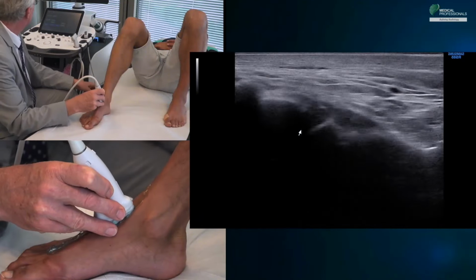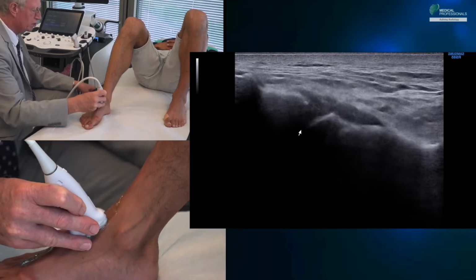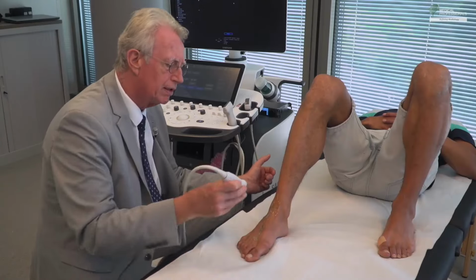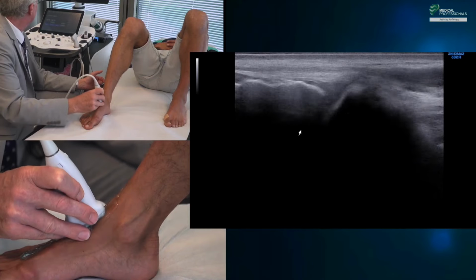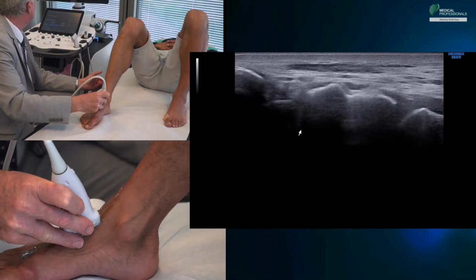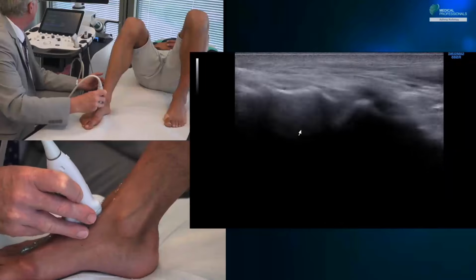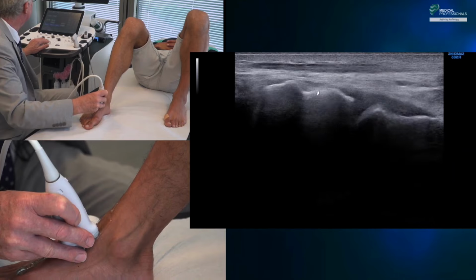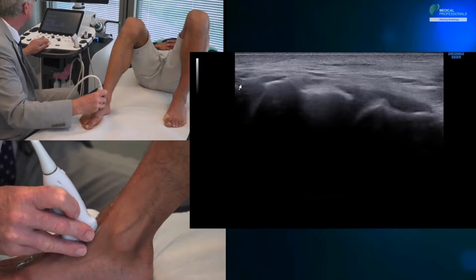Then naturally, we continue on the dorsal talonavicular ligament, especially with a sprain. But in other cases, there are two main things to consider. One is the bony contours, because many patients have osteoarthritis problems in the region of their medial tarsal joints. The second is the Chopart joint, and this osteoarthritis, which will lead to dorsal synovial swellings or small synovial cysts that are painful to palpation.